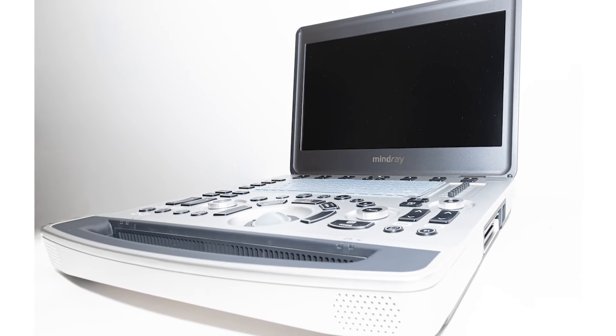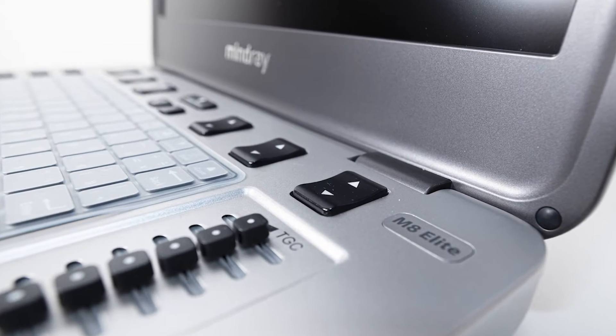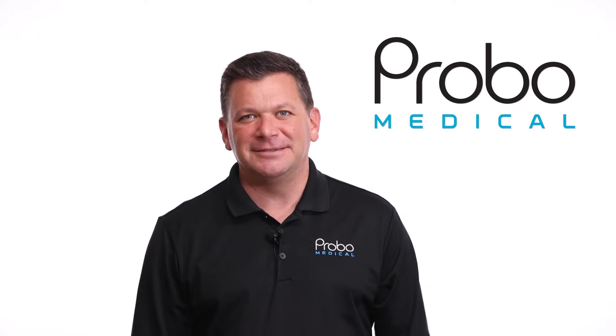The Mindray M8 Elite replaces the very popular M9. Yes, I said that correctly — the M8 replaces the M9. Makes sense, I guess.